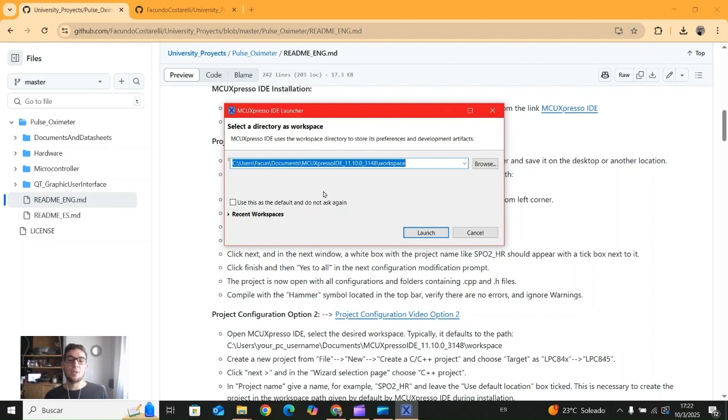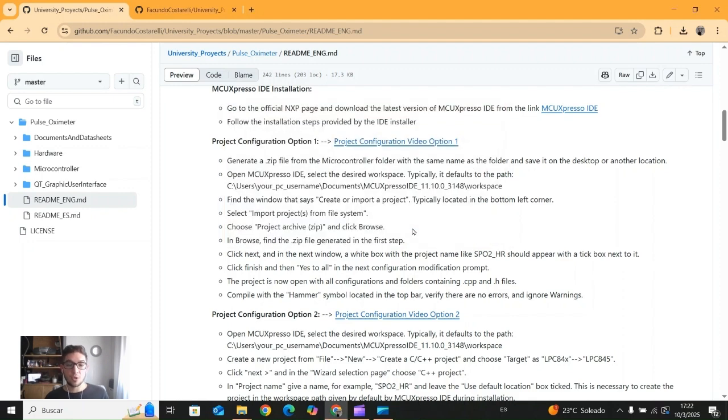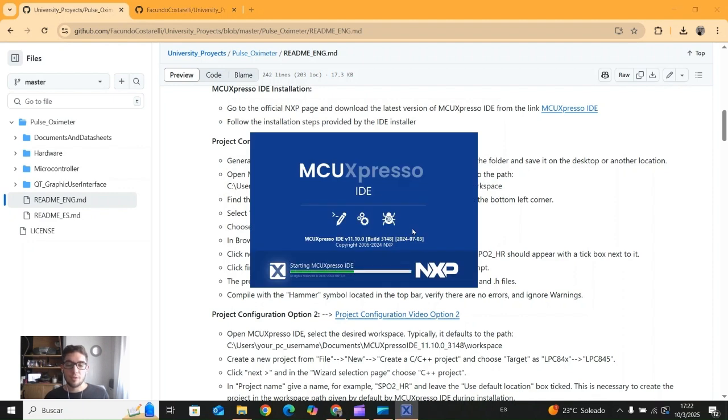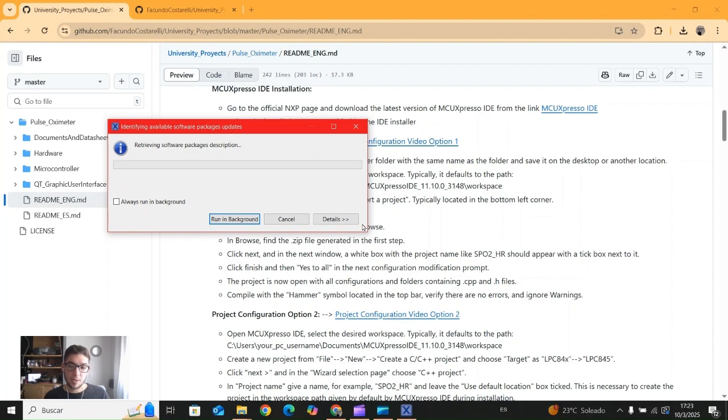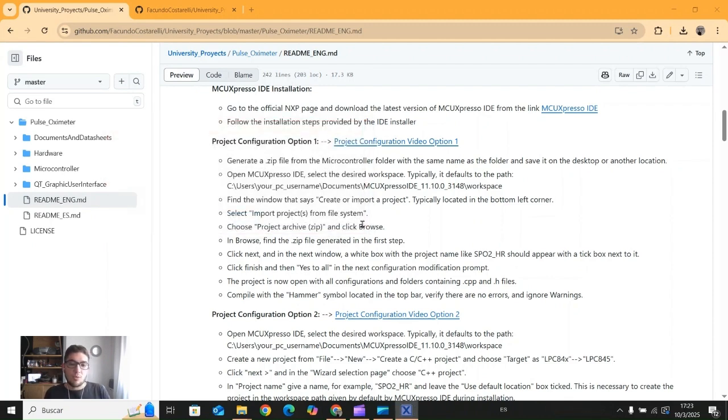Typically, this is the main root. When you download the MCUXpresso IDE, it suggests a root. This is the typical root: users, the name of the user, documents, then the folder MCUXpresso IDE and the version, and then workspace. Workspace is the folder where all your projects are going to be available for the MCUXpresso IDE to read. So I recommend you maintain the same root. Do not change the root. Maybe you can import or use another workspace folder, but who knows how it is going to work? Typically, there are plenty of problems when you open a project from anywhere else that is not the default root.